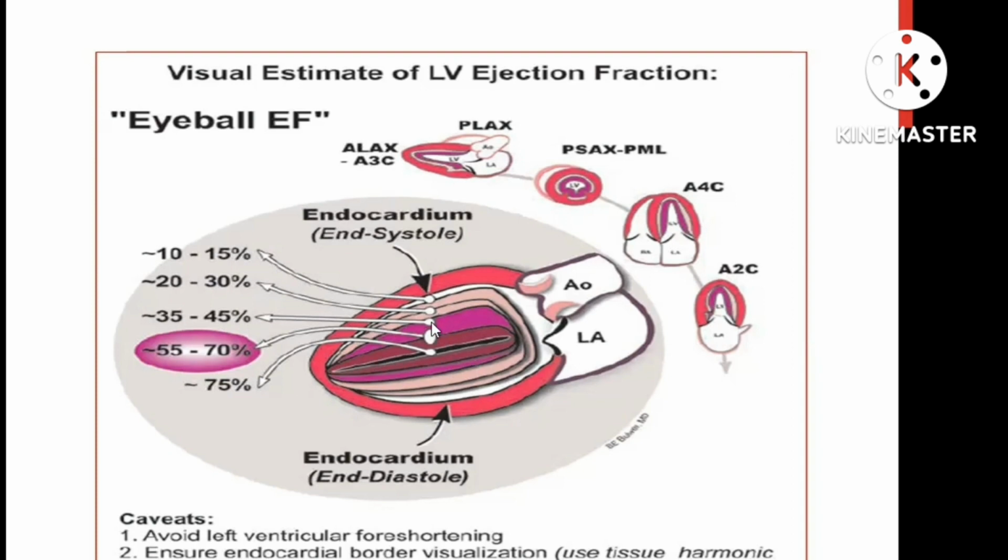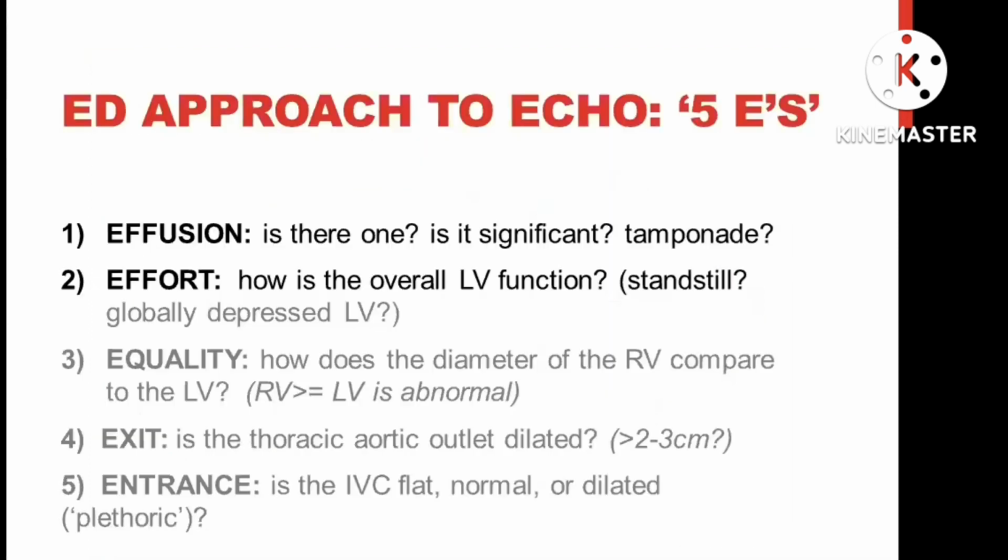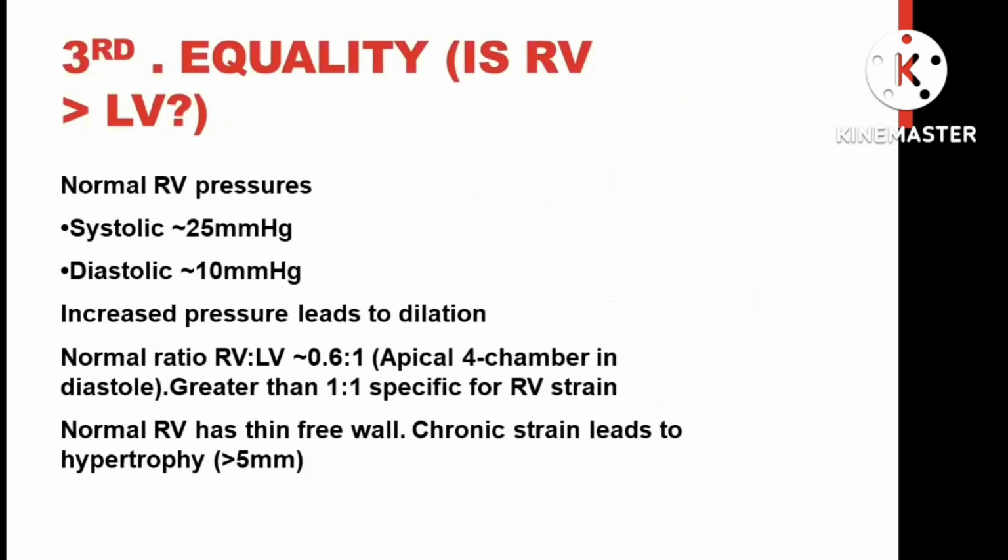The other thing you should see is the mitral valve. The mitral valve should touch the septum, and the interventricular septum should thicken during systole. So one is the direction, two, the interventricular septum should thicken, and the third one is the mitral valve should touch the septum. Clear?